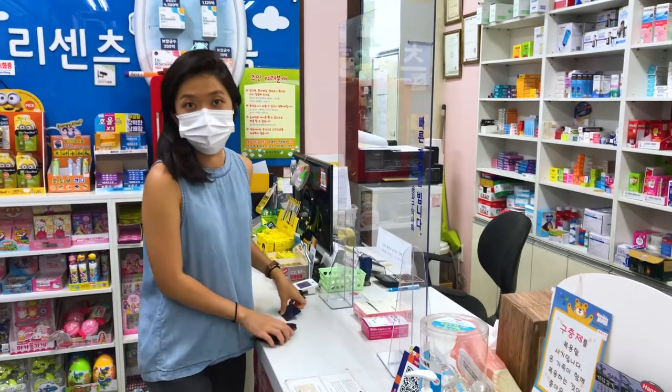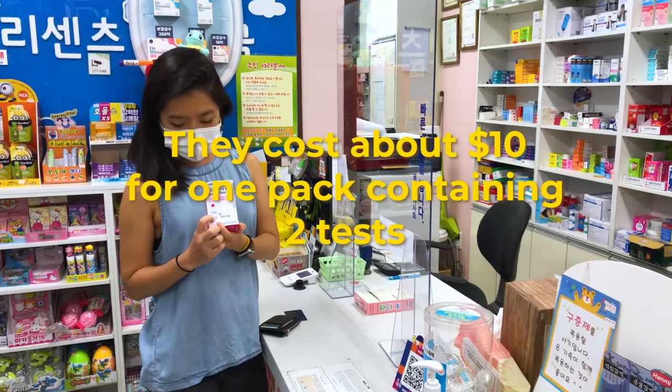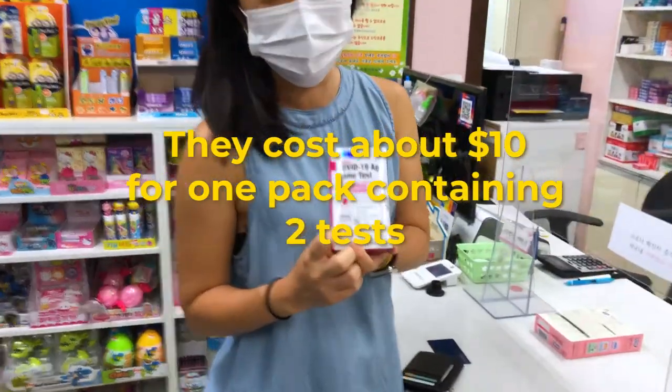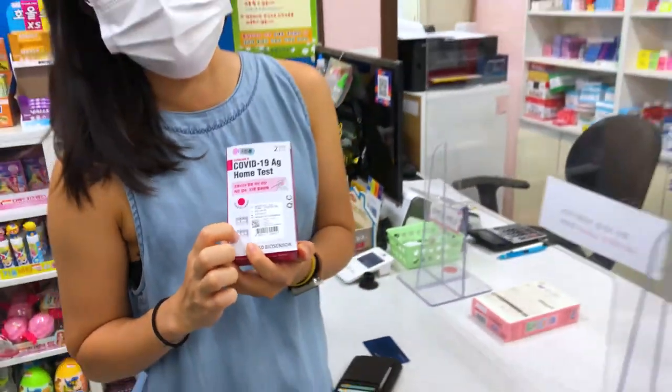Colin's buying it now, right? It's a pregnancy test. Not pregnant. I guess it's not COVID — it's COVID.